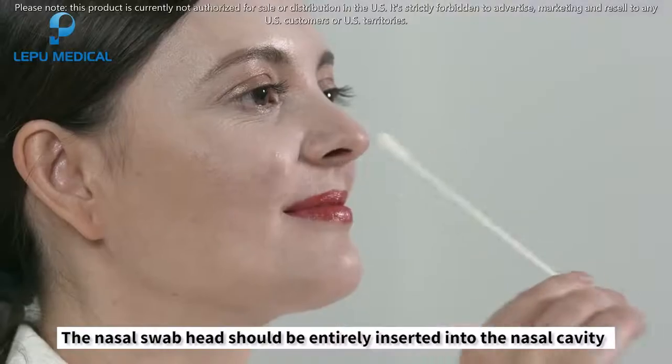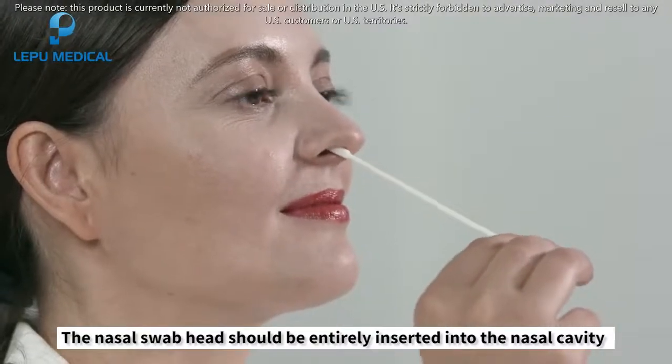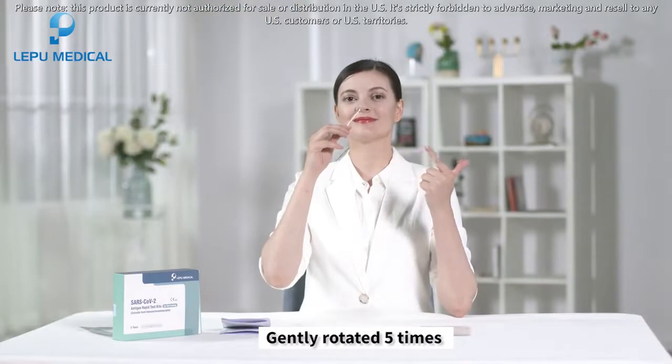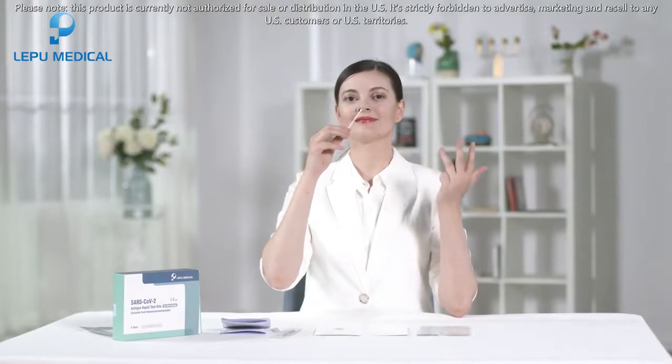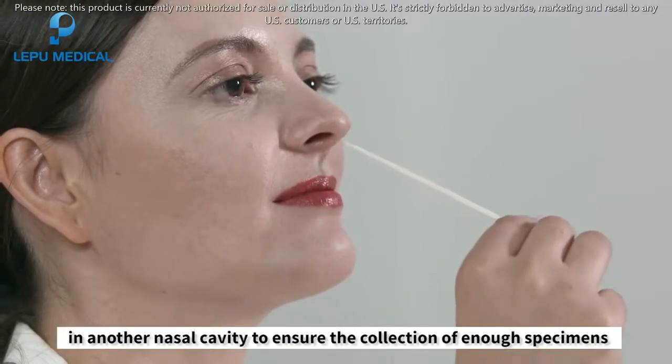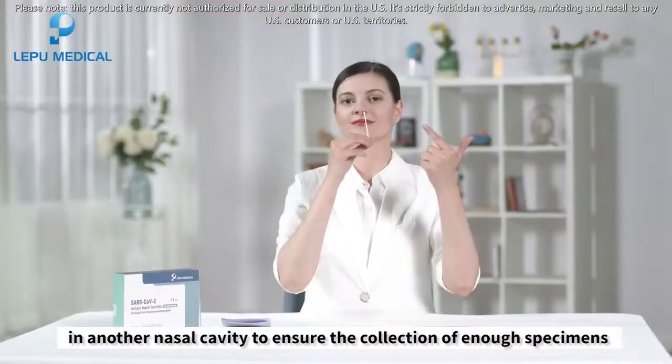The nasal swab head should be entirely inserted into the nasal cavity, about 2 to 3 centimeters, and gently rotated 5 times. Specimens should be taken in the same way in another nasal cavity to ensure the collection of enough specimens.